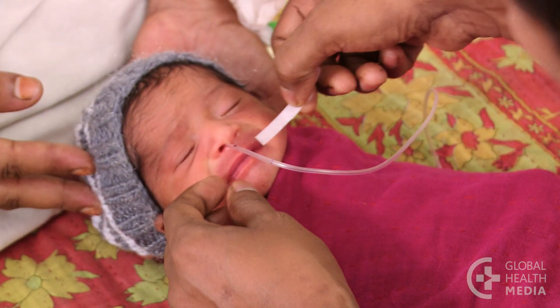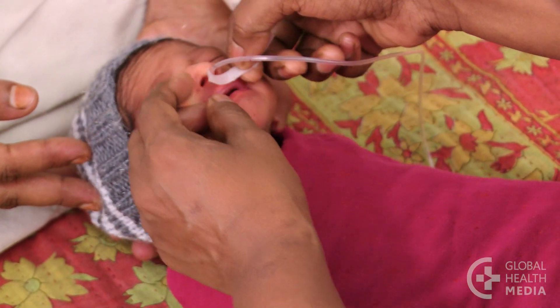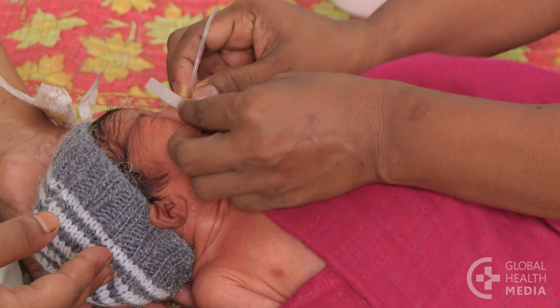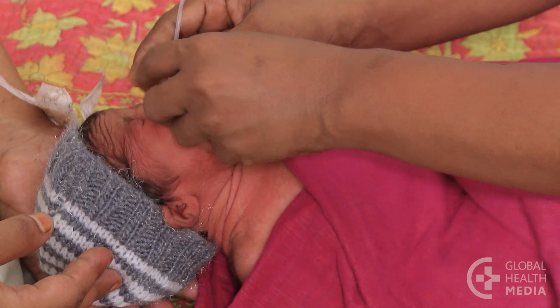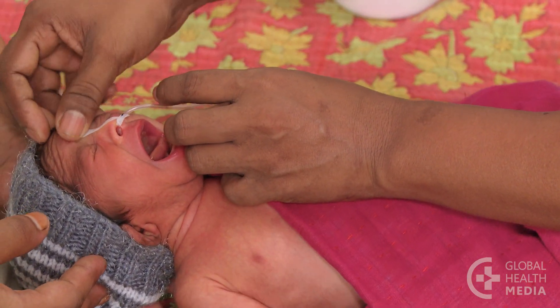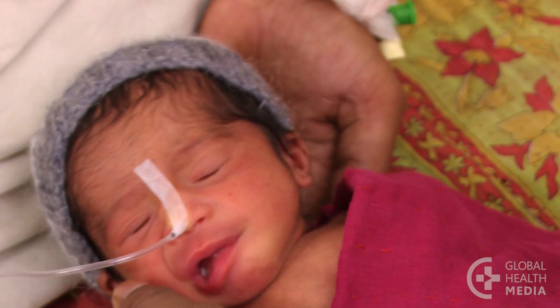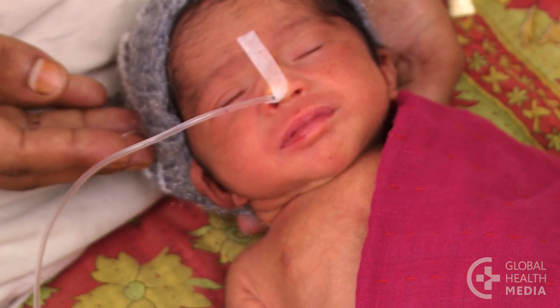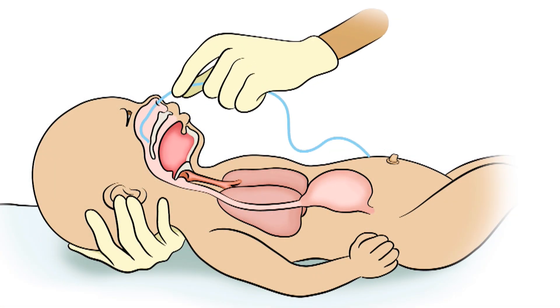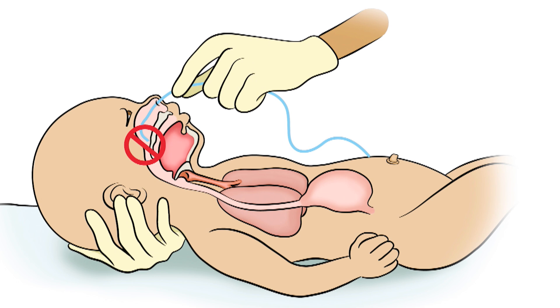Once the tube is inserted to your mark, tape the tube in place, keeping your mark visible near the nose.